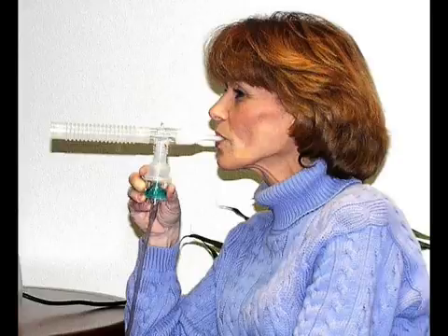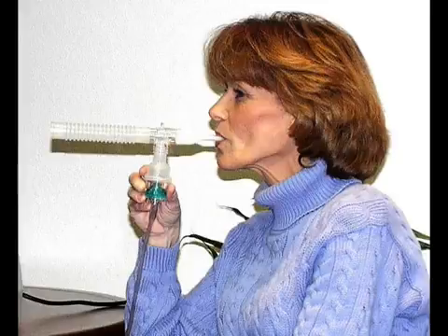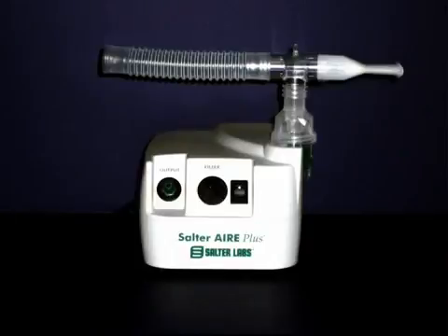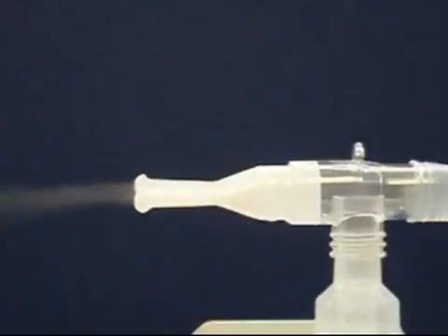If you must stop your treatment before all the medication in the nebulizer is depleted, simply turn off your compressor and return the nebulizer to the docking station on the front of the unit. Usually, a treatment will last from 6 to 8 minutes. When the treatment is finished, the mist will stop.